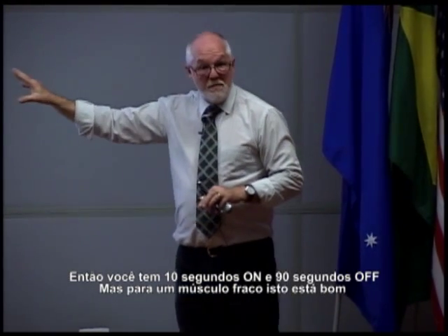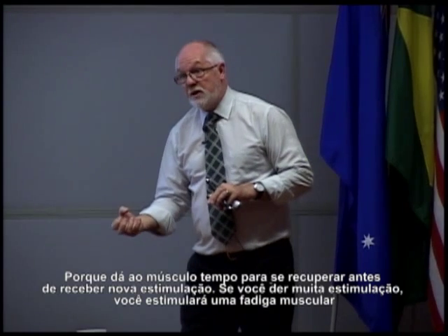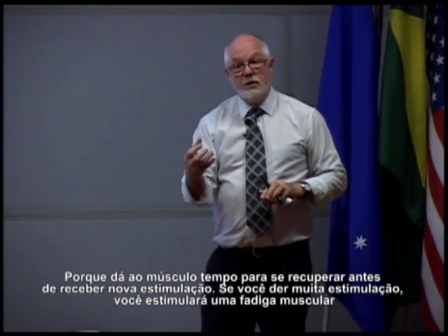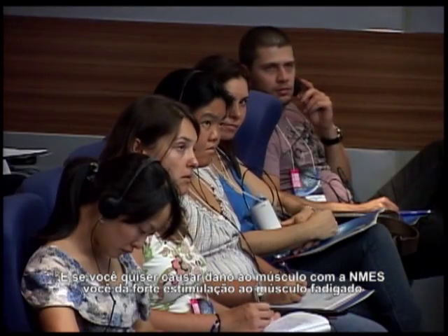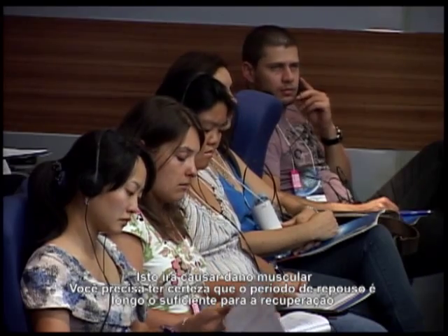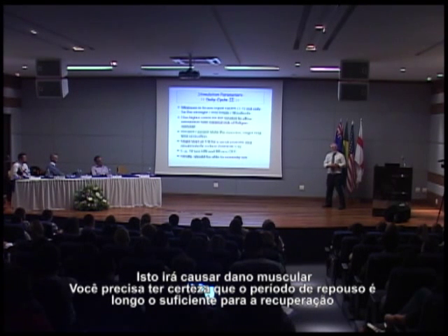But in a weak muscle, that's good because it gives the muscle time to recover before you hit them with the next stimulation. If you do too much stimulation, you will stimulate a fatigued muscle. And if you want to damage muscle with NMES, you do strong stimulation on a fatigued muscle. It will cause muscle damage. So you need to make sure the rest period is long enough to get recovery.